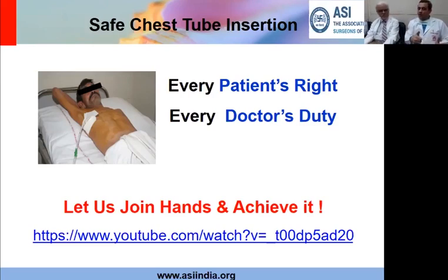So a patient who is on a ventilator or may go on a ventilator, even if he's meeting all other criteria for removal of the chest tube, you will hold on till the patient comes on spontaneous breathing. The reason is, if this patient who's on a ventilator has any amount of pneumothorax, within a few minutes it will convert into tension. Therefore, you don't. And that is the reason why, if the patient is on a ventilator and has a chest tube and has any air leak, clamping the tube is a big no, banned, because you will immediately precipitate tension.